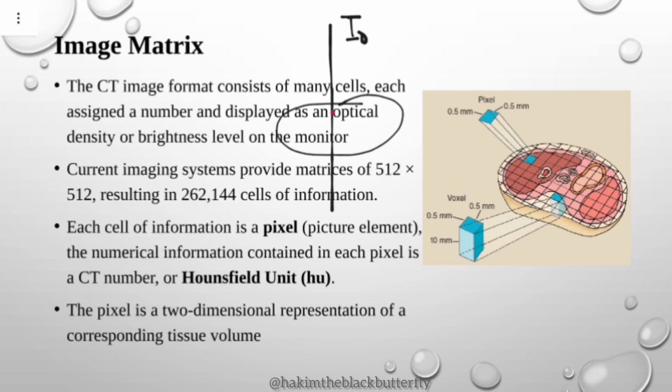But when the beam goes through the patient, there will be some attenuation of this beam. You don't expect the same intensity to go through the patient. So the post-patient detectors measure I, the final intensity falling on them. And then they feed those values into this equation, I is equal to I naught exponential minus mu x.